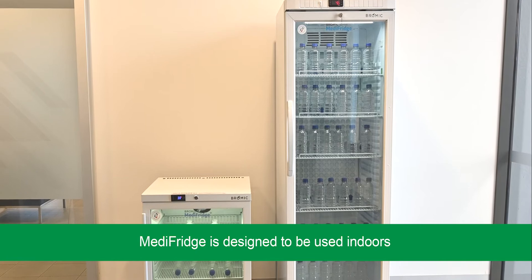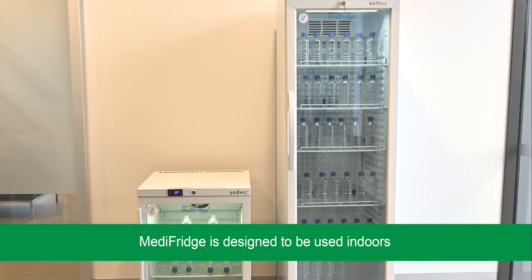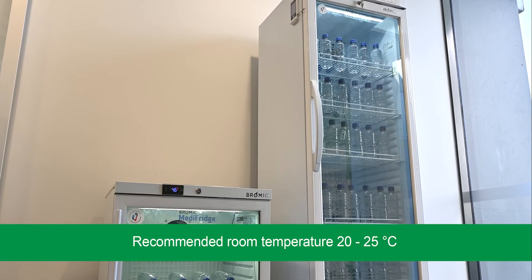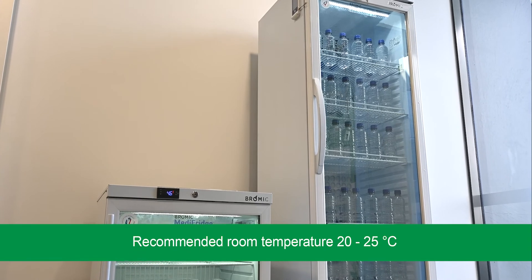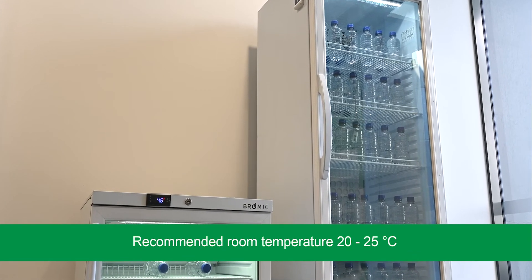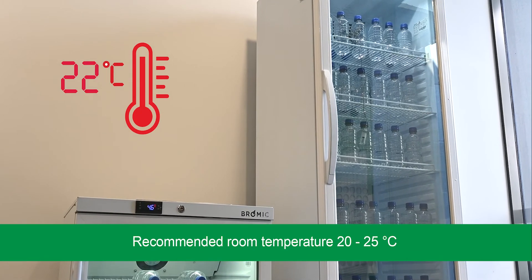Ambient conditions. Your Medi-Fridge is designed to be used indoors in an environment of no higher than 30 degrees Celsius. A room temperature higher than this may negatively affect your Medi-Fridge's ability to maintain the safe temperature range of 2 to 8 degrees inside the unit. For best performance, we recommend keeping the room temperature between 20 to 25 degrees Celsius.